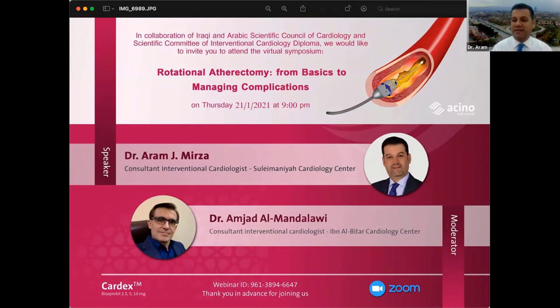So that's why, yes, in these cases, and I don't know whether you agree with me, I am going to choose a bit bigger. Personally, I'm on the side of taking the ratio of 0.5 to 1, not 0.6 to 1. But in these cases, I'm going to go 0.6, something like that, to the 1 ratio. I'm going to choose a bit bigger just to make more plaque modification. But this is one of the worst scenarios, where definitely the result will not be so good.